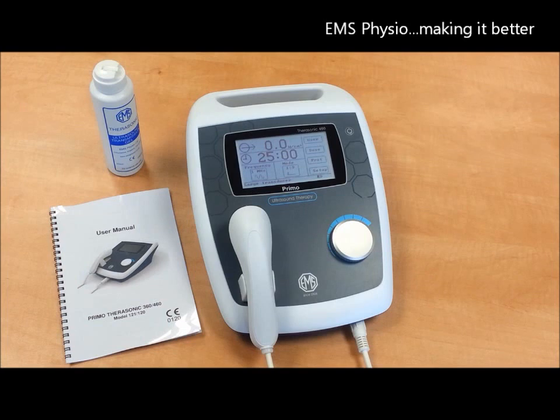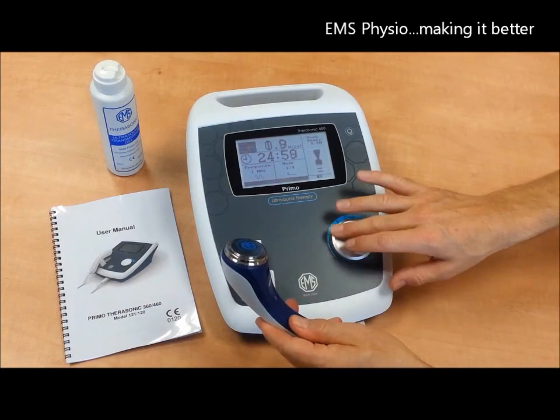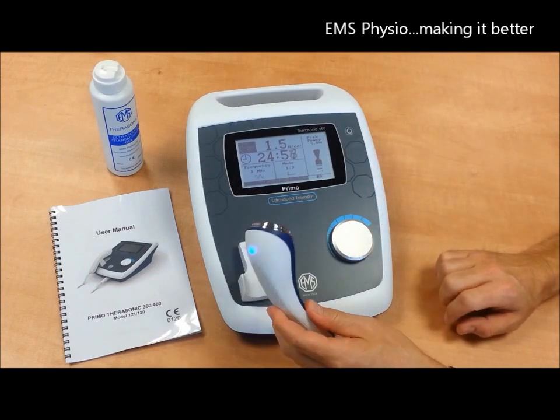The Therasonic 460 has an inbuilt safety audio alarm which warns you in the event of poor contact.